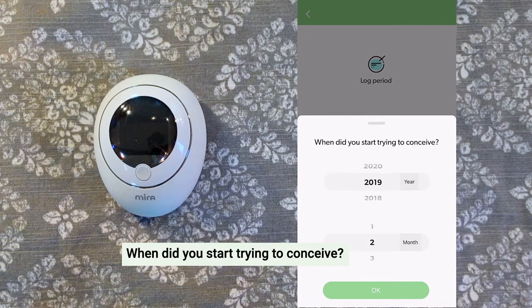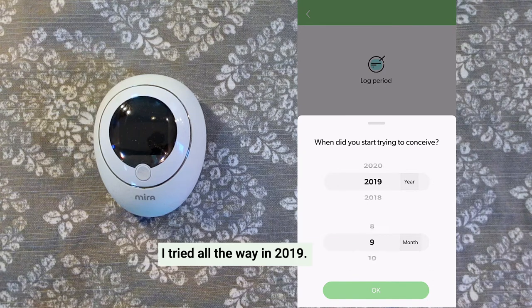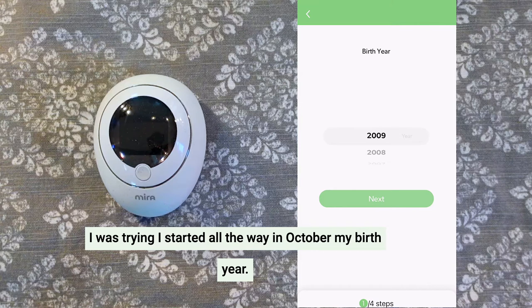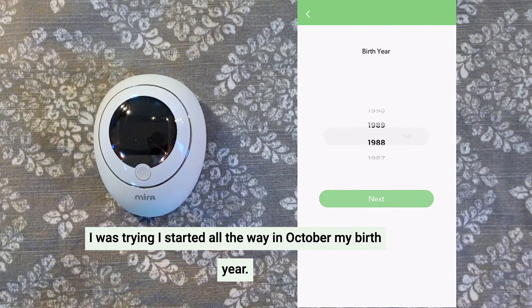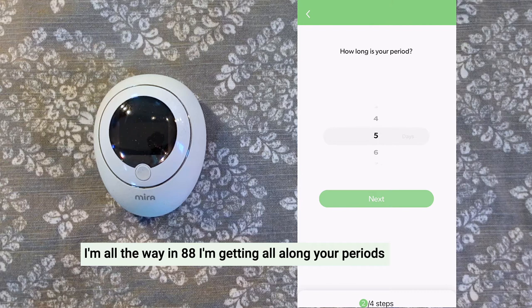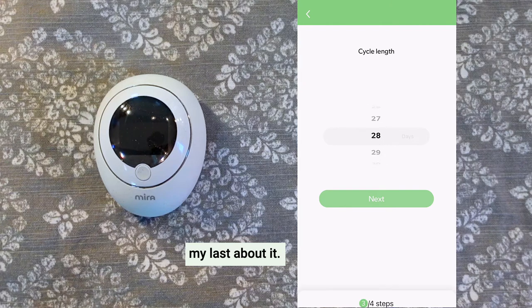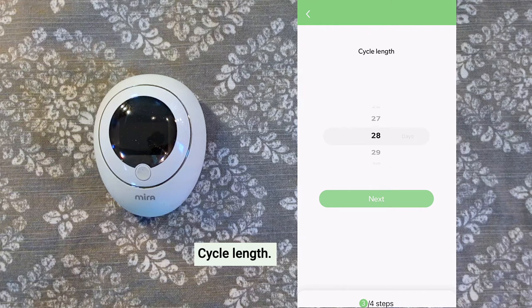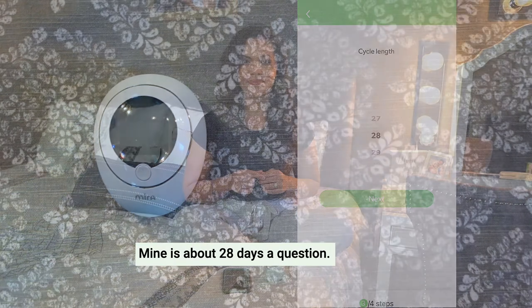When did you start trying to conceive? I started trying all the way back in 2019, beginning in October. My birth year — I'm all the way in '88, I'm getting old. How long are your periods? Mine lasts about seven days. Cycle length — mine is about 28 days.